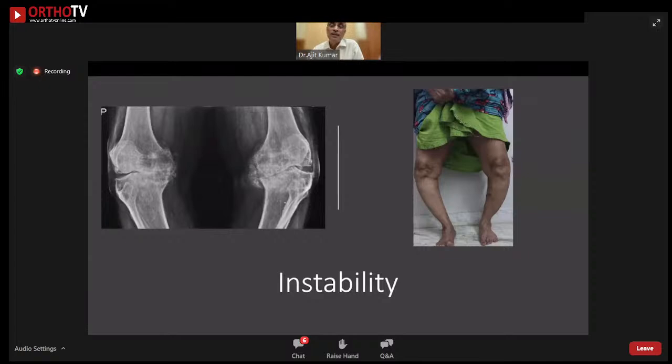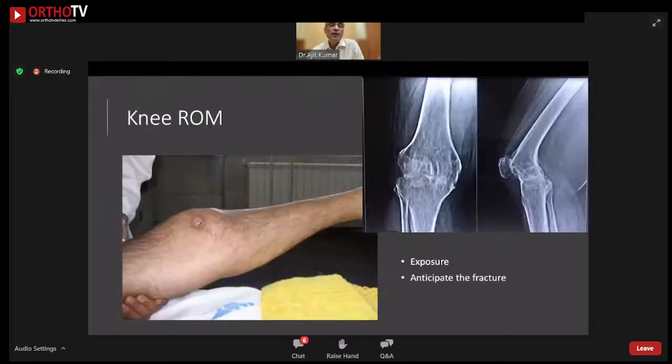When you have a severely deformed knee like this, watch the patient walking. Look for the varus or in some cases valgus thrust so that you know the ligamentous stability. Also, in such severe knees, there is significant bony deficiency. So you need to be prepared with alternative equipment like wedges or even sleeves in certain situations, or even a higher constraint knee. So you need to assess these patients thoroughly preoperatively.